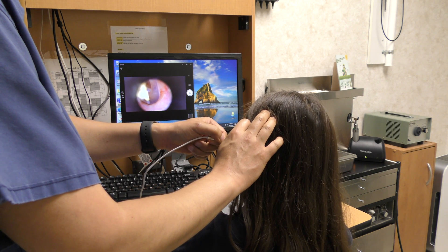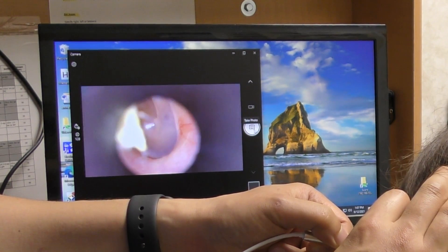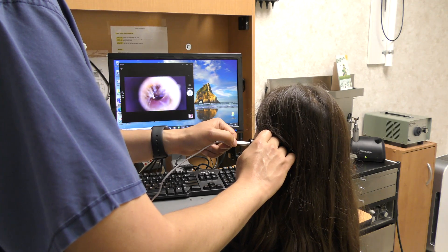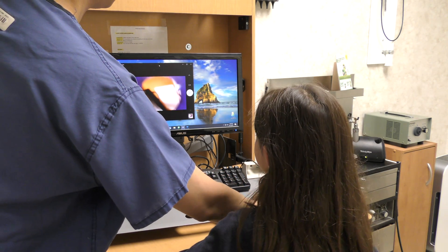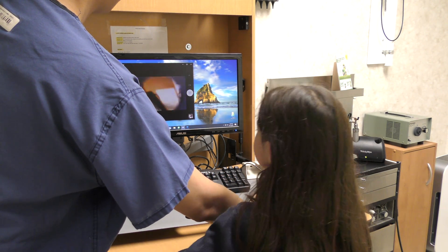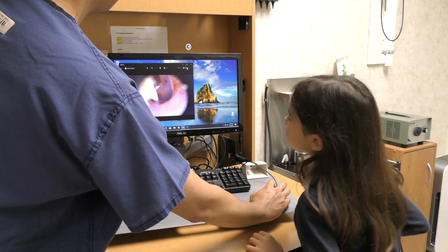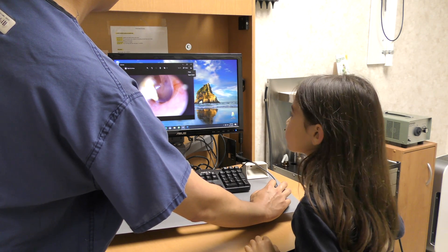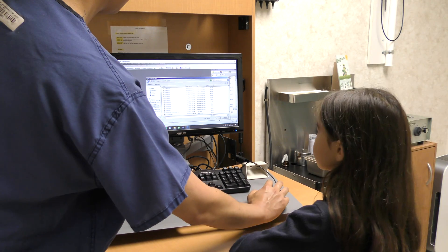For this child, one can clearly see earwax debris in the ear canal along with the eardrum. Other ear pathology can be easily visualized as well if present. A video or photo can be recorded and saved to the desktop, and from there it can be uploaded into an electronic medical record system for both documentation and future reference.